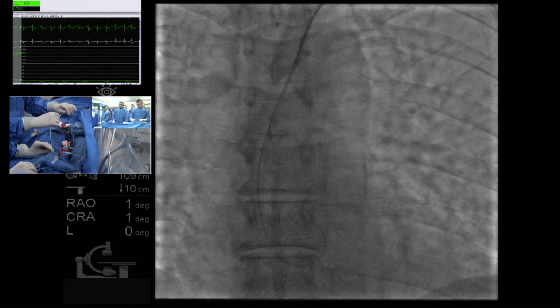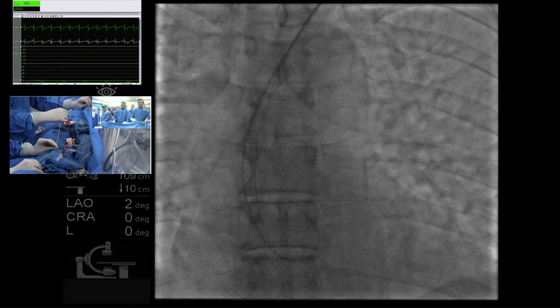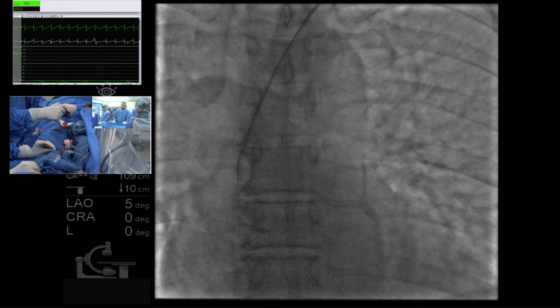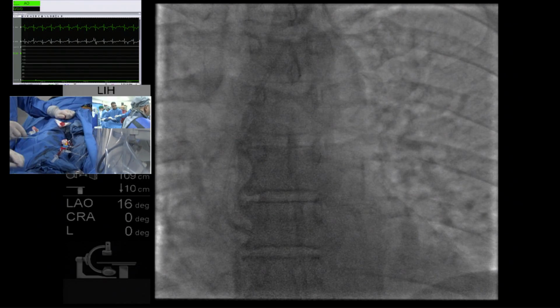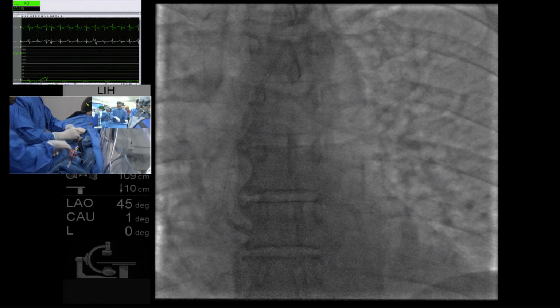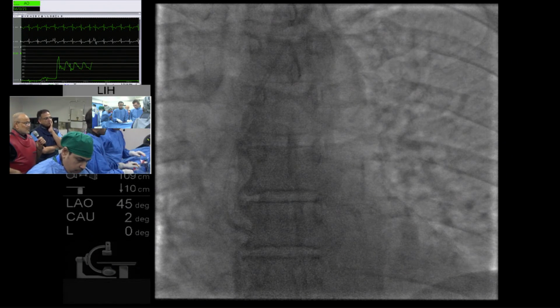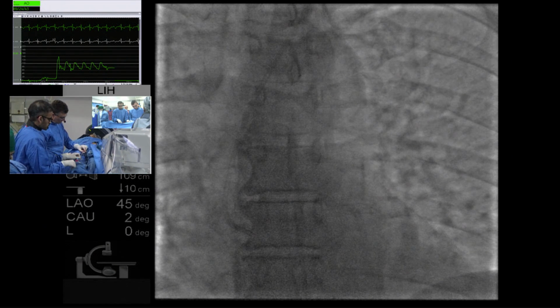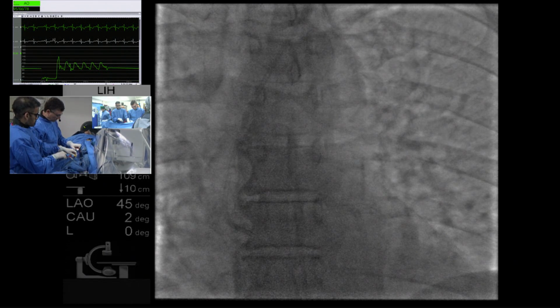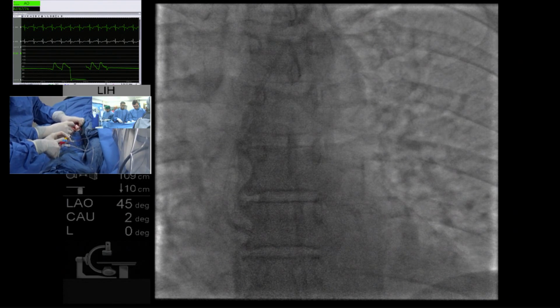If we were going through the left radial approach and right cannulation, again for the beginner, there is one word of caution: the catheter will have a tendency to dive very quickly inside the right, particularly with its downsloping, and that is the reason why Mauricio has selected AR1.